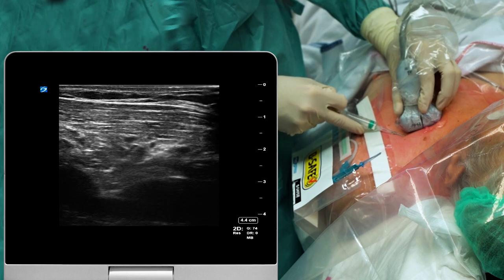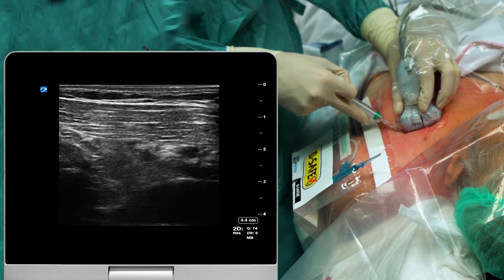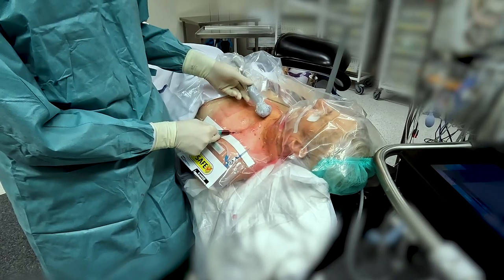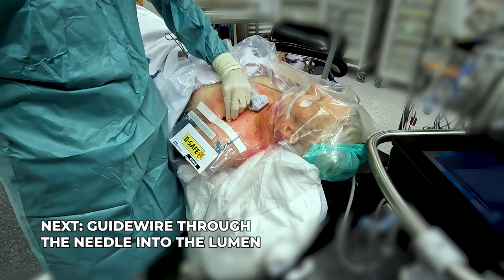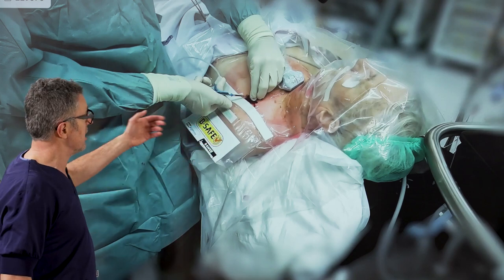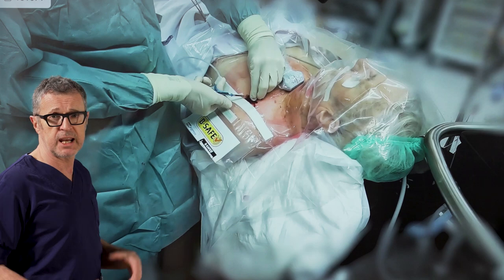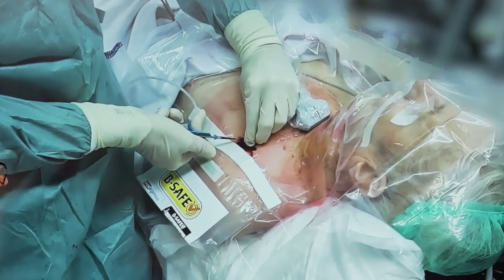Once the needle enters the blood vessel wall you will see a return of blood in the syringe, which signifies that we are now in the subclavian vein. Disconnecting the syringe allows us to see the pattern of blood flow. If this were an artery we would see a gush of blood, but that was not the case here, and the color of the blood clearly indicates that it is venous blood.